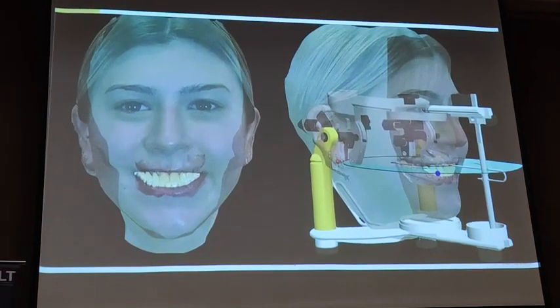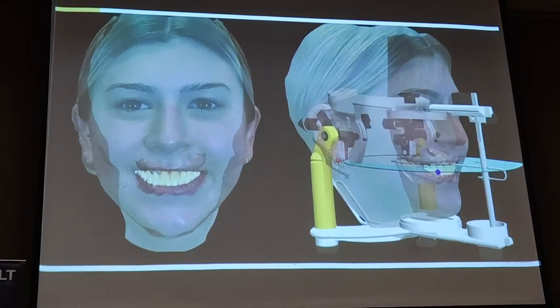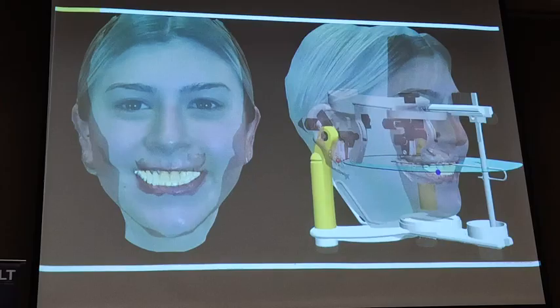As Sir told, technology is a double-edged sword. If you use it for good, you can use it for healing. On the other end, you can use it for bad things, right? The same way here also, digital smile design totally depends on the data you get from the clinician. If you get clear, good, precise data, you'll be able to deliver good processes. If the data is wrong, 100% your planning will go wrong, right?